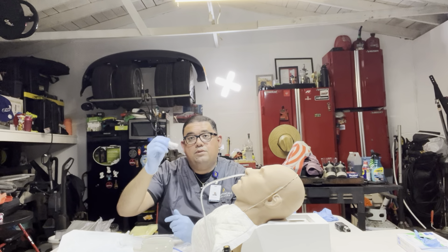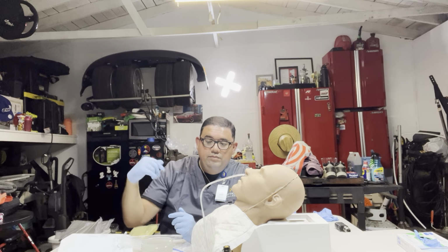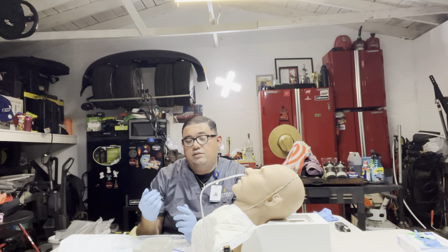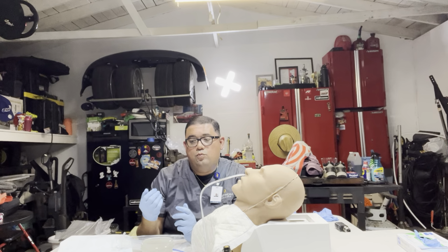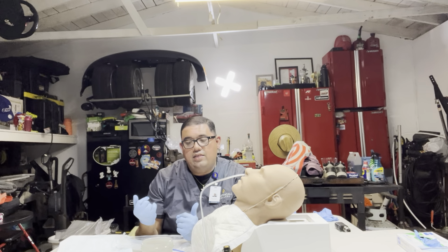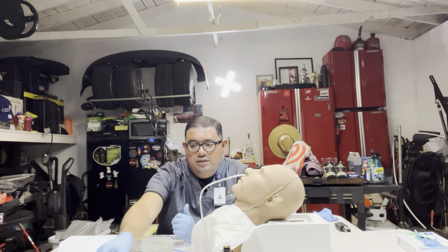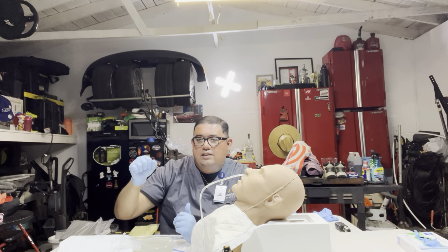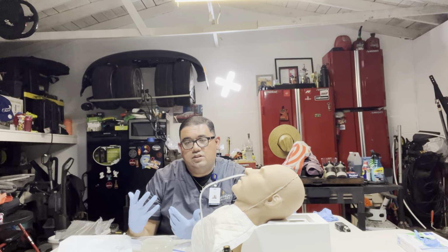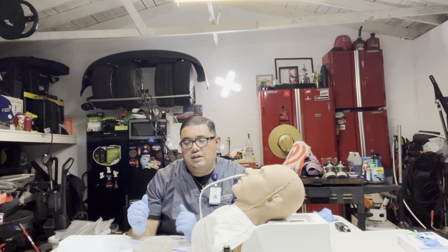Then with our pH paper, we're going to test the gastric contents. The pH should be between 1 and 5. If it's between 1 and 5, that means we're in the stomach, gastric region. So we're good. We got that done.